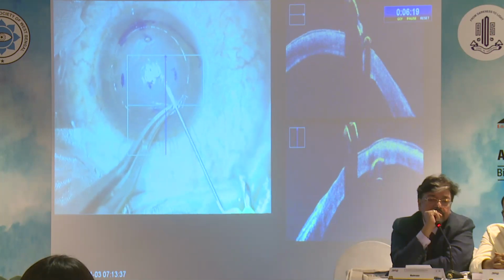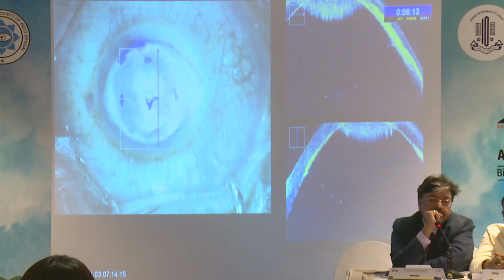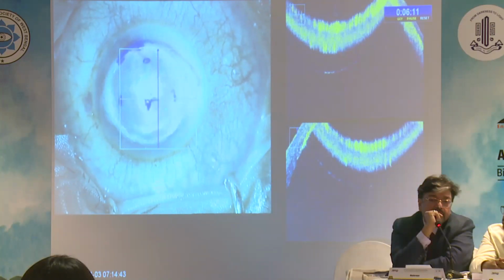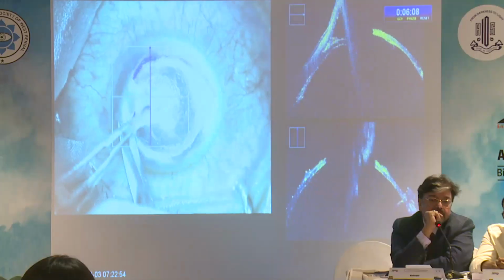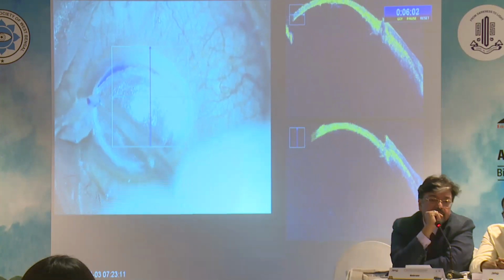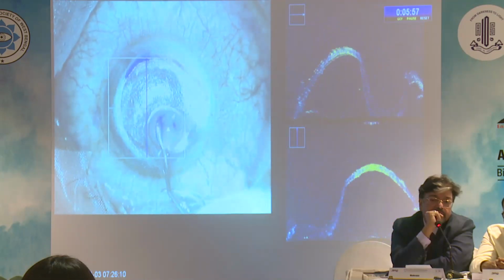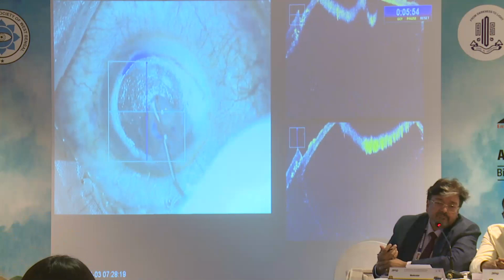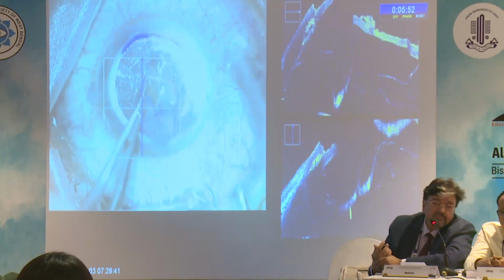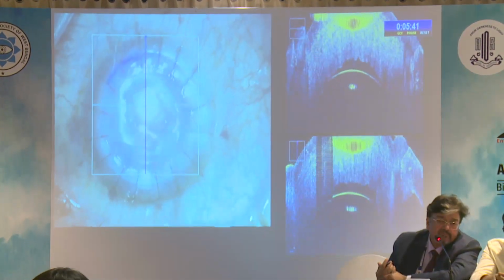Intraoperatively, successful formation of the big bubble was confirmed on IOCT. Lamellar dissection was done to debulk the cornea, and a nick was made in the stroma to allow escape of the big bubble, followed by removal of the stromal layers to expose the host Descemet membrane. The donor button was sutured on the host Descemet membrane with 10-0 interrupted monofilament sutures. Surgery was completed uneventfully and there was no intraoperative perforation.